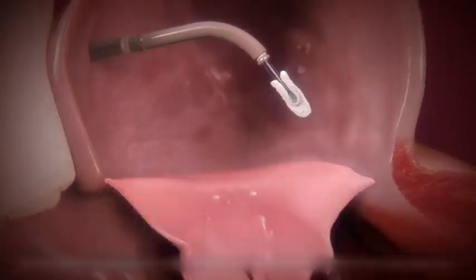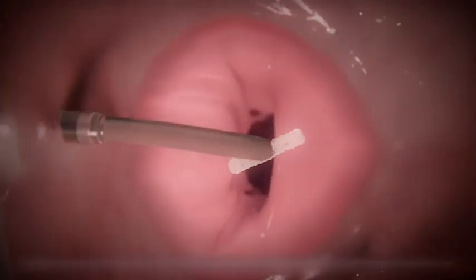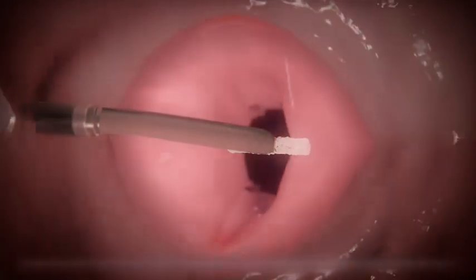Inside the left atrium, the clip arms are opened to 180 degrees and positioned perpendicular to the line of coaptation before crossing into the left ventricle.